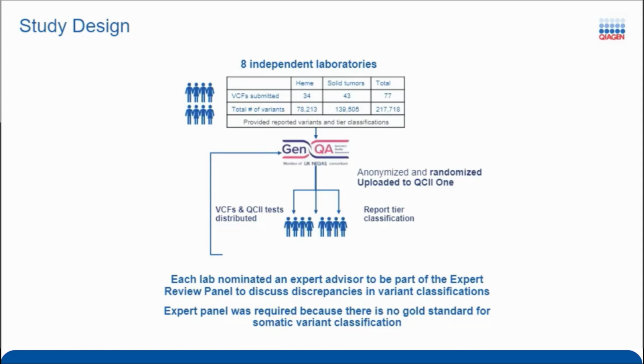So from a yes, it saves time, you are able to go out and with this type of platform and others, scour so many different data sources and get a better understanding of what is out there and get a much more complete picture of the information available that you, as the person doing the interpretation, should consider. However, now that you're presented with all that information, you have a lot more thinking to do.